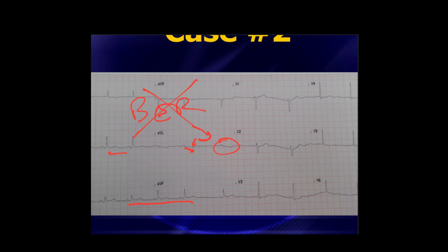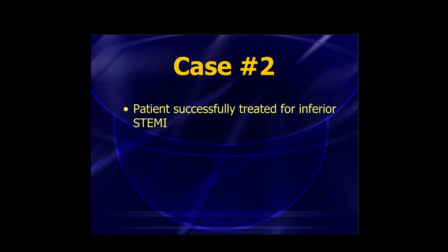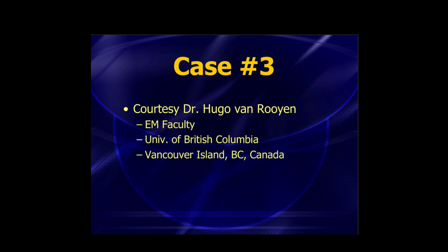But Satish got a repeat 12-lead ECG 30 minutes later, and you remove all doubt. AVL is looking worse, and now there's new ST segment elevation. The first thing you saw was just the ST segment and T-wave changes, the reciprocal changes in lead AVL.